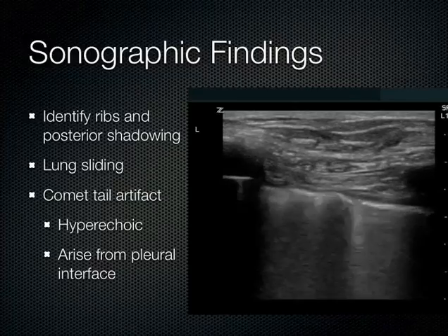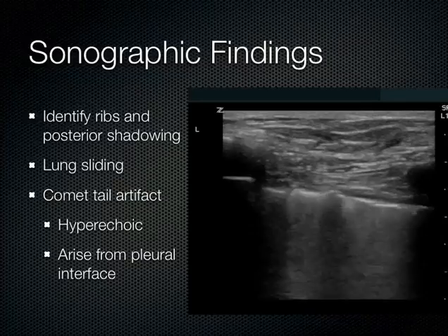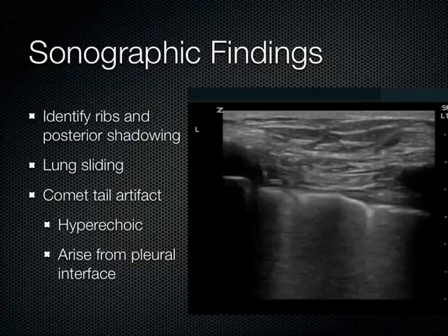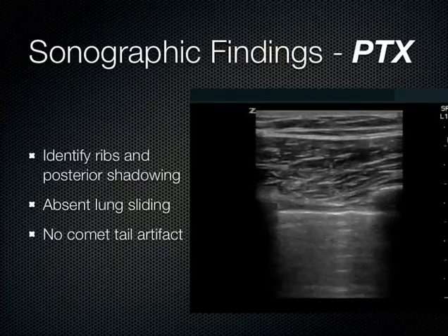Okay. Pneumothorax, however, this patient is breathing, not holding their breath. So you do see some movement of the chest wall because the patient's intercostal muscles are still contracting, but as far as the sliding, you don't see anything anymore.